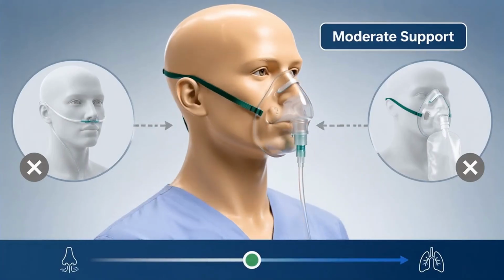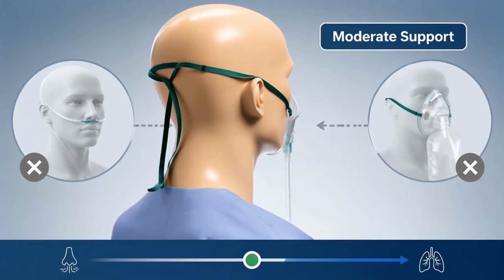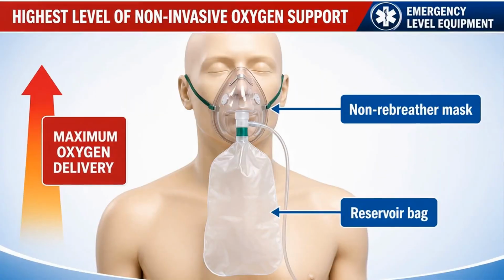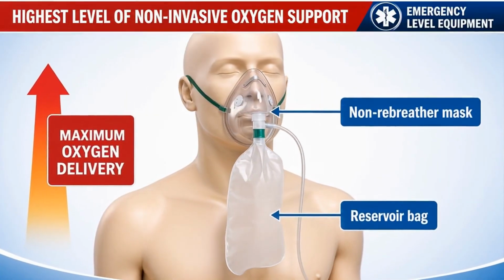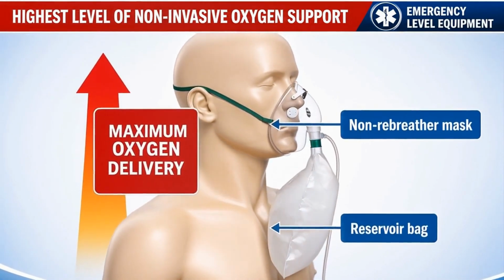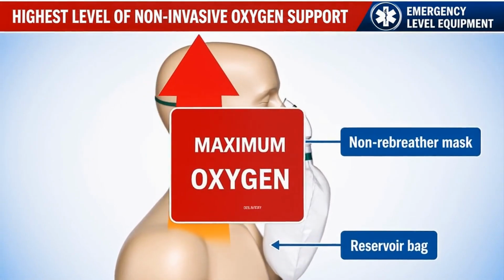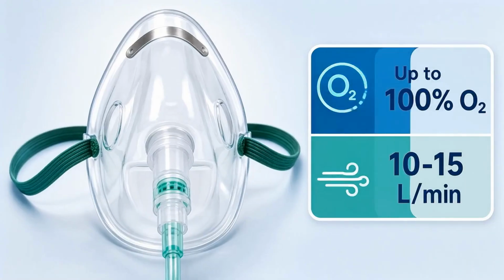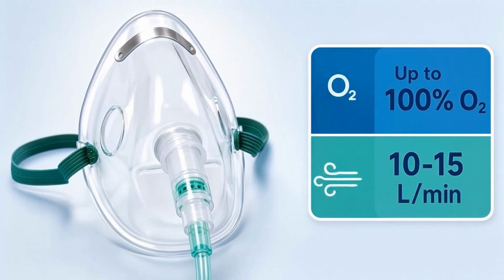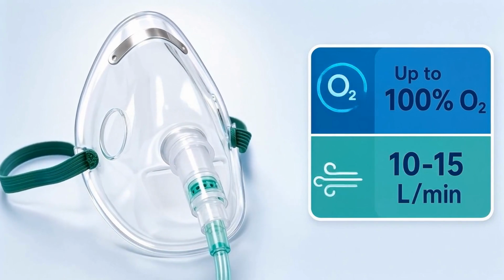This mask is ideal for patients who require moderate oxygen support but are not yet in a state of severe respiratory failure. Now, consider the non-rebreather mask. This device delivers the highest oxygen concentration possible without resorting to intubation or mechanical ventilation. It can provide up to 100% oxygen. This is achieved with high flow rates ranging from 10 to 15 liters per minute.